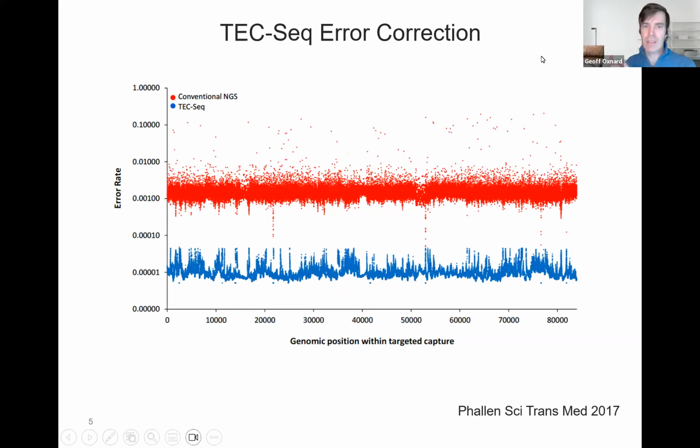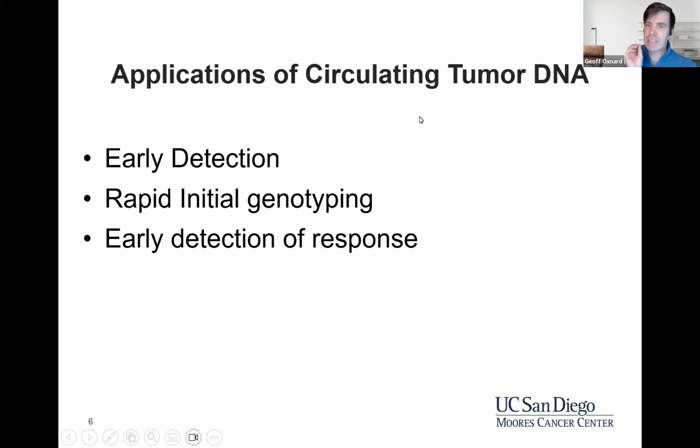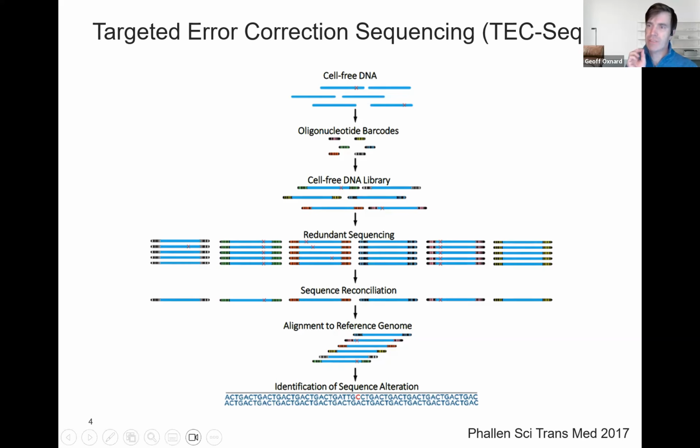One of the reasons this is so great for ctDNA is that it's a very clean, fresh specimen with little artifact. And so you can find stuff way down at 0.1%, tiny low-level signals that you wouldn't be able to do in tumor specimens because they are historical, FFPE handled, there's much more noise. And so you would never call a tiny low-level signal in a FFPE sample because of the handling leading to artifact.